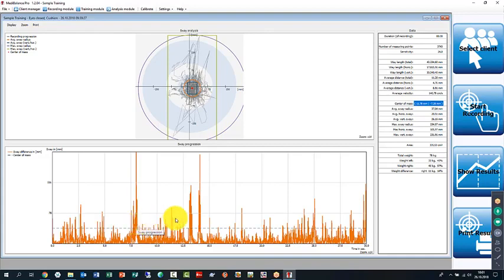And usually in clients that freeze, that stand perfectly still in the beginning, the curve would start to move up at the end, because you can only do this for so long, like 10, 15, 20 seconds, but it's very hard to maintain this state of freezing and not moving at all for more than 20 seconds. So usually you will see an upgoing orange curve at the end of your measurement.